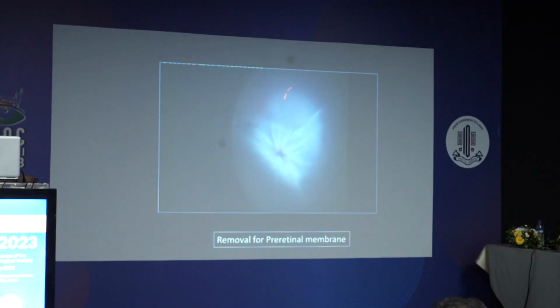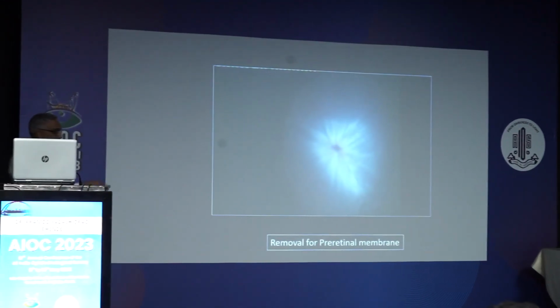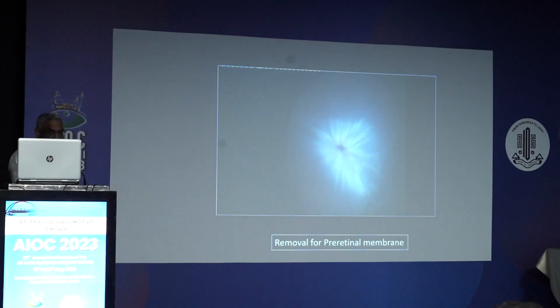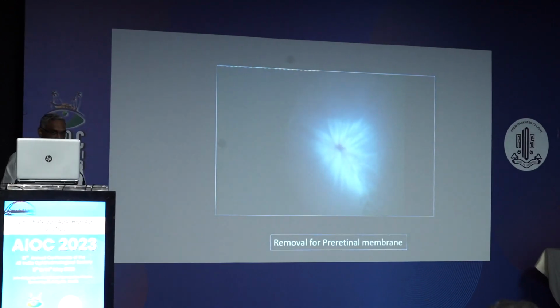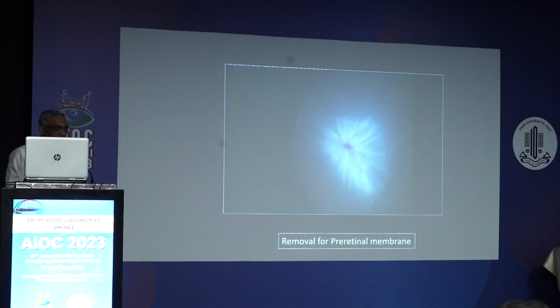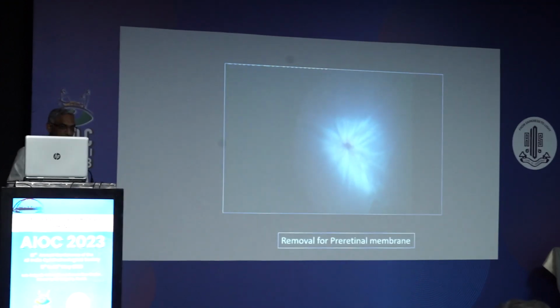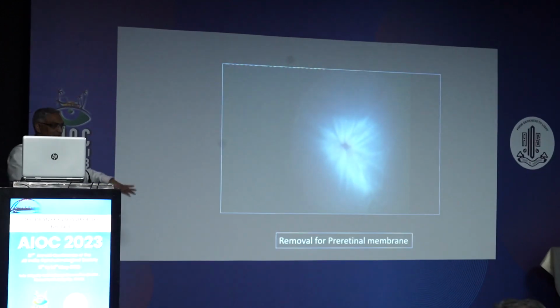Now you can see subretinal bands here, there were multiple subretinal bands showing around, and the puckering you see here is mainly because of more subretinal fibrosis than preretinal membrane. Preretinal membranes were not much. Now, he has subretinal silicone oil also. You don't want to just remove the silicone oil from the subretinal space first. Once you cut the retina for that, the retina becomes mobile, and if you have preretinal fibrosis, membrane removal becomes difficult because there is no counter traction. In fact, the underlying oil keeps the retina stretched, so it's easier to peel the membrane and ensure that all the membranes are removed. Then you go for subretinal oil removal.